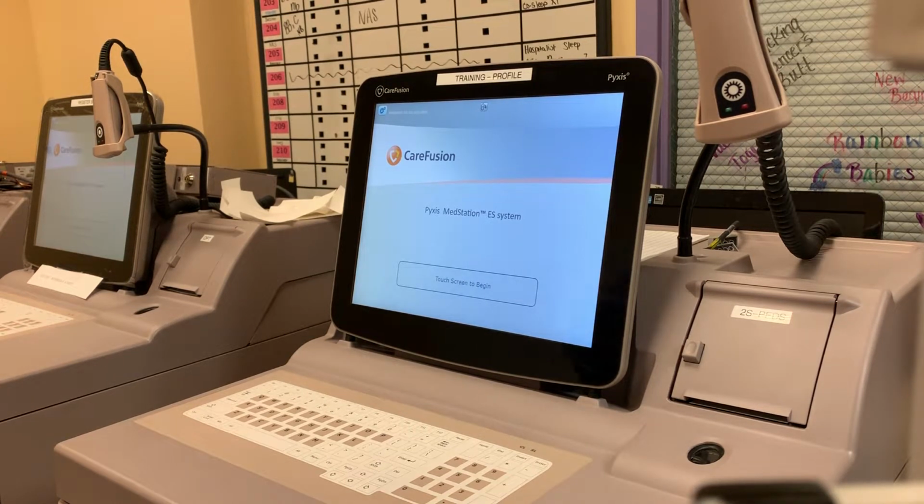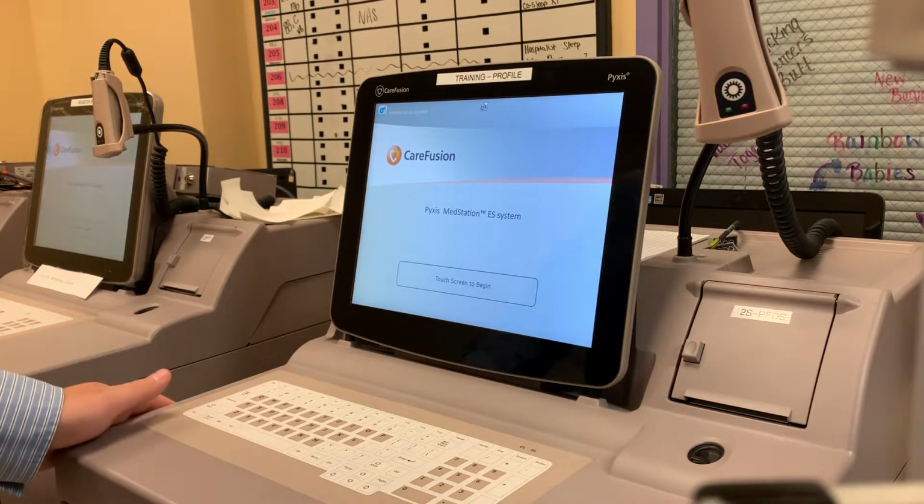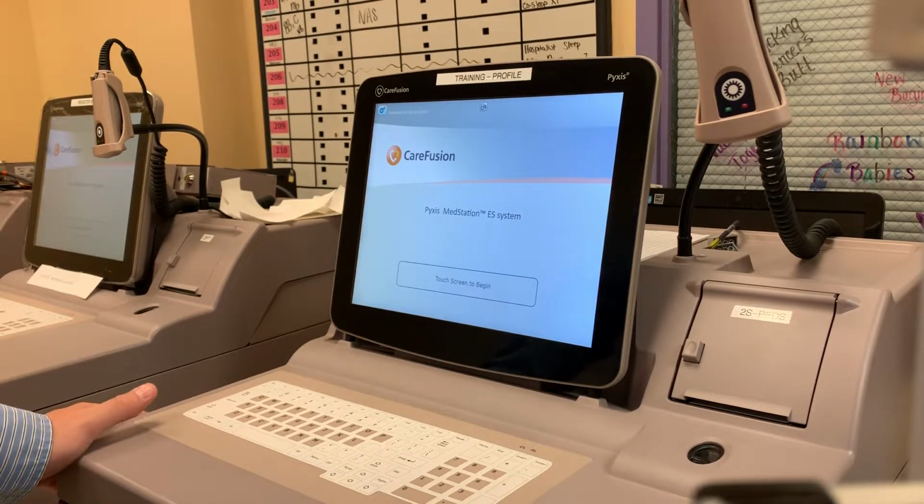Hello, this is the new Pyxis training to get you ready for when we go live real soon. And so let me take you through it real quick. This should take no time at all.